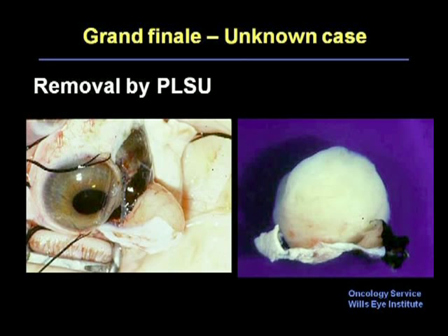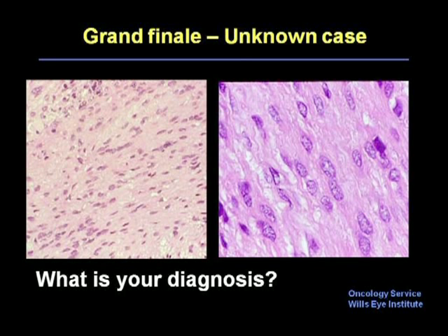And you can see as the tumor came out very nicely, and you can see with a nice scleral base this amelanotic dome-shaped mass. And here's the pathology. Anybody want to venture what type of melanoma this is? Spindle cell melanoma? Or is it something else? It might be something else, right? Well, since you haven't got the diagnosis yet, I'm going to give you a hint.